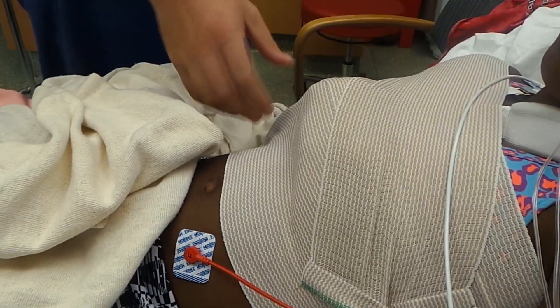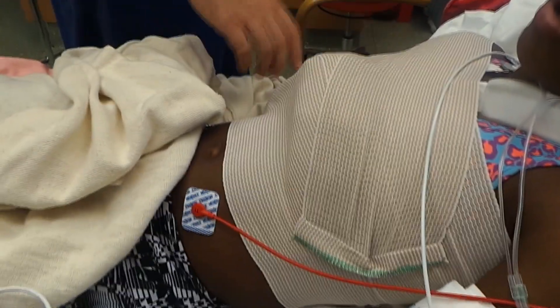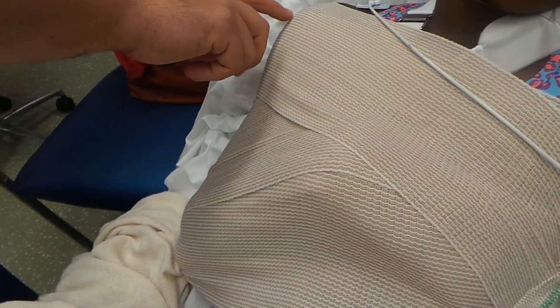So this is a cuff and collar — a device that wraps around the neck and at the wrist. It kind of immobilizes the shoulder, but at the same time it allows gravity to maintain reduction of the fracture of the proximal humerus.